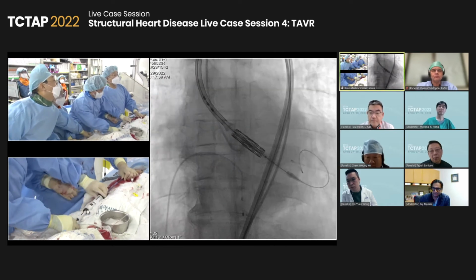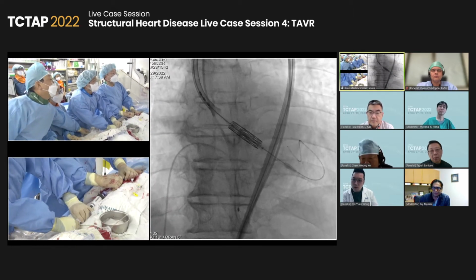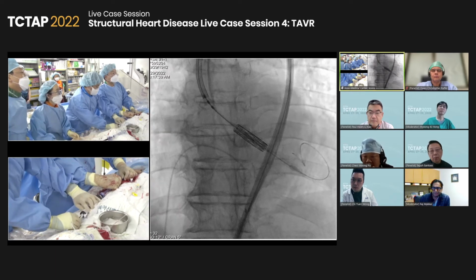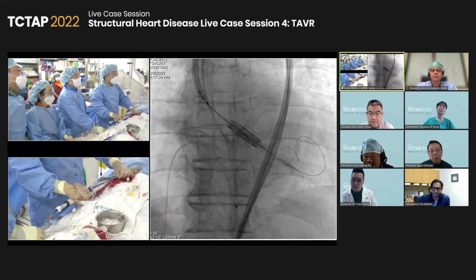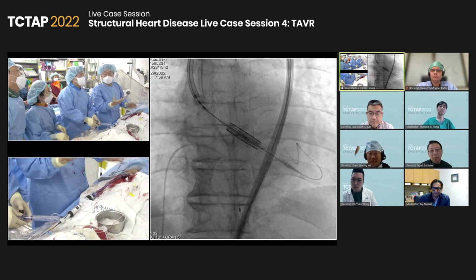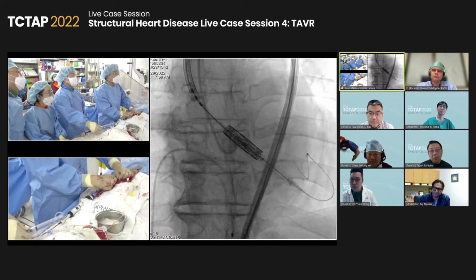Anyway, we are going to do a little bit more fine accommodation of the placement of the device. Push out up to the second dot or third dot. And then I really want to do still coaxial. One more thing, please. Great. Test.